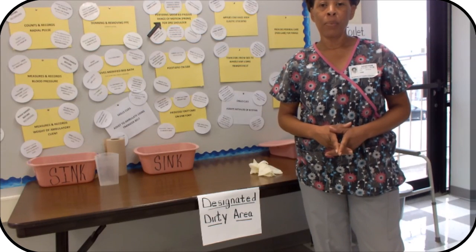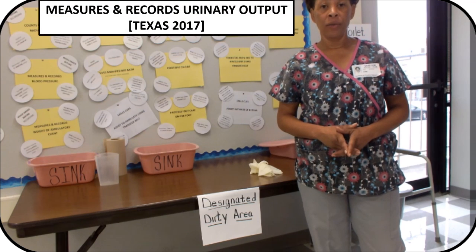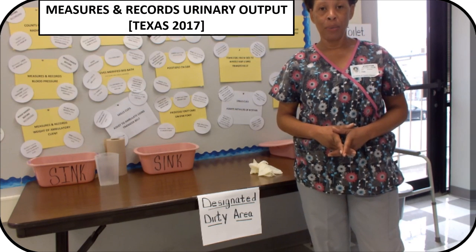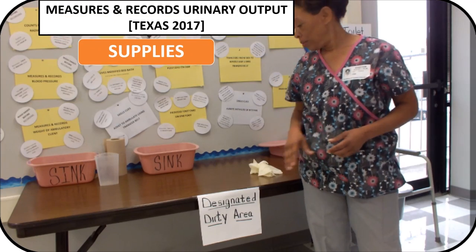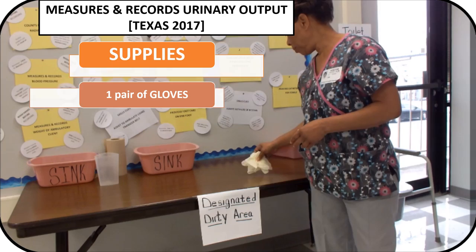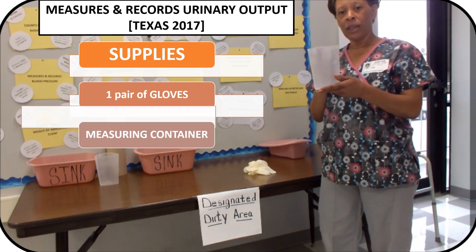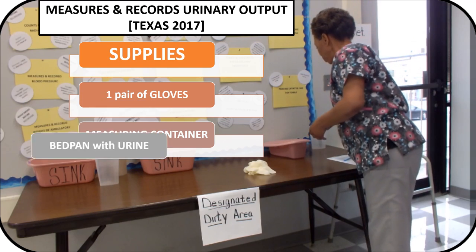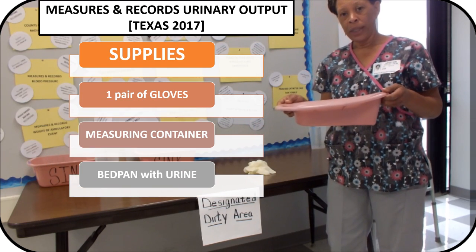In this video, I'll be performing the CNA testable skill: Measures and Records Urinary Output. The supplies that you will need for this skill are one pair of gloves, a measuring container, and a bedpan with urine.